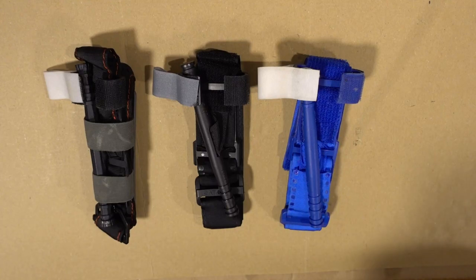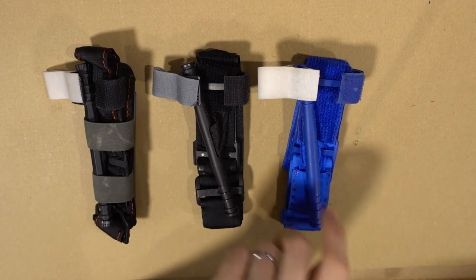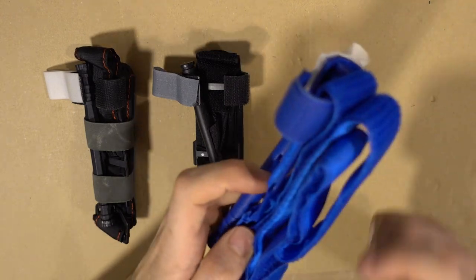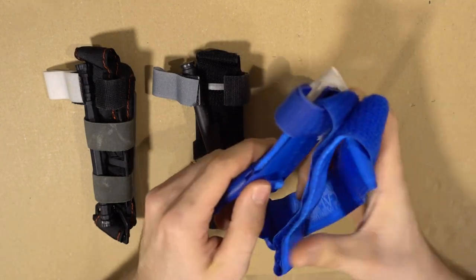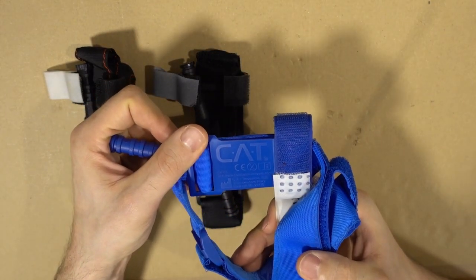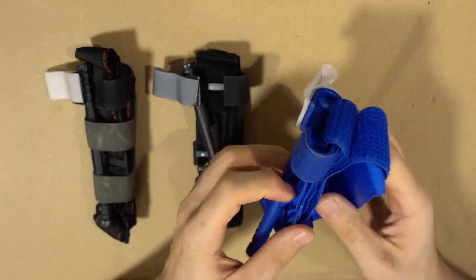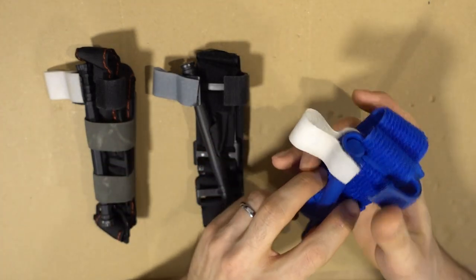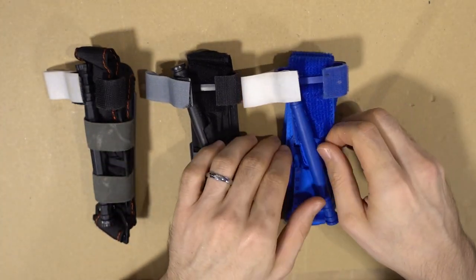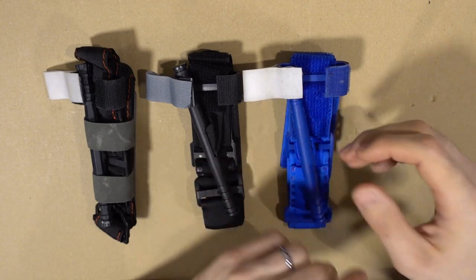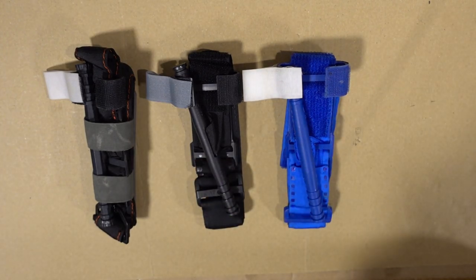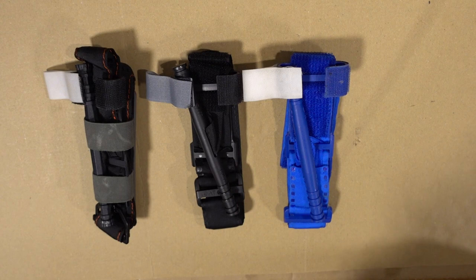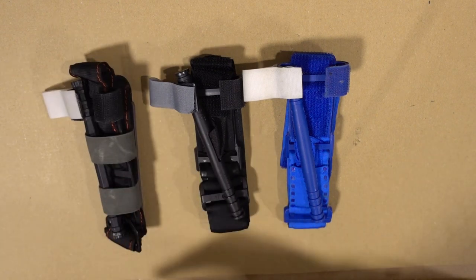Today I'll show you how to apply a tourniquet. I will do the demonstration with the most common one, the CAT combat tourniquet. It's one of the most common ones for a reason. They have a very reputable history, they're easy to use, and are recommended by lots of institutions that did some testing.